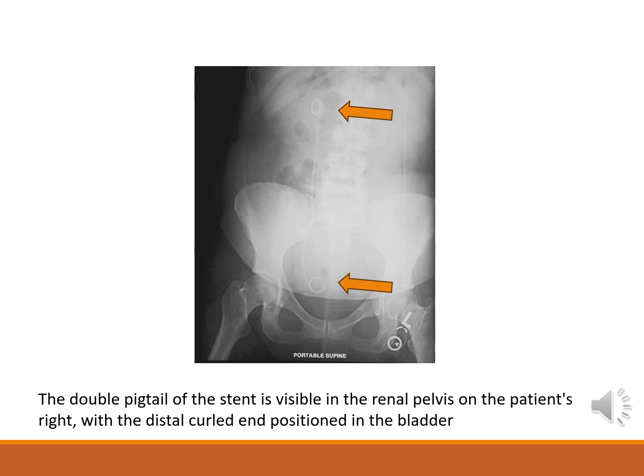If a patient has an obstructed ureter due to a stricture, edema, or tumor, a stent made of soft, pliable silicone may be temporarily or permanently inserted to relieve the blockage, either surgically or during a retrograde pyelogram. Complications from having a stent can include infection and obstruction from incrustation or clot formation, with the technologists handling imaging while the physician and nurse manage patient care and instructions.